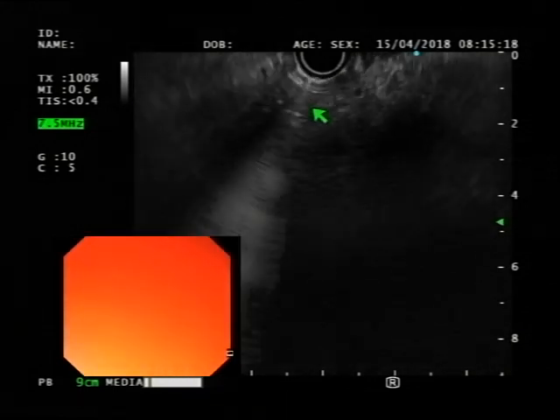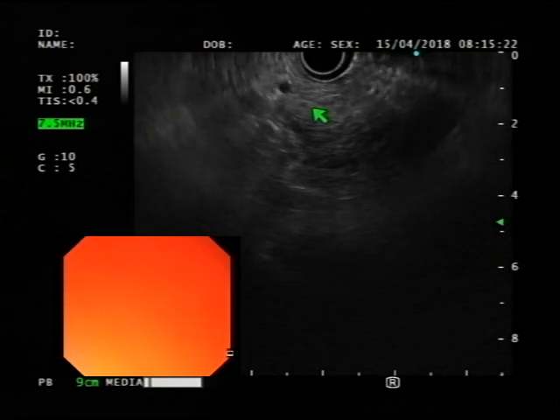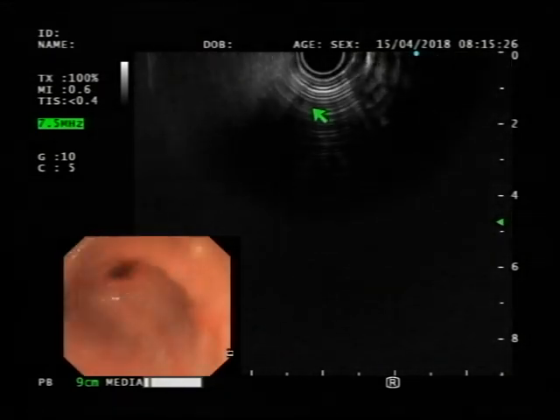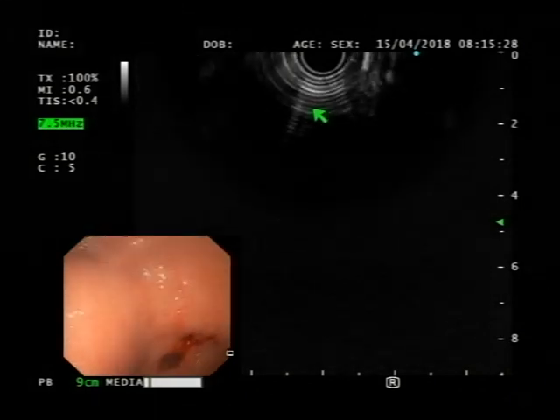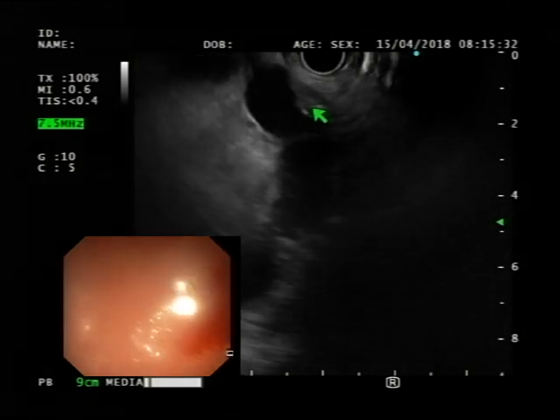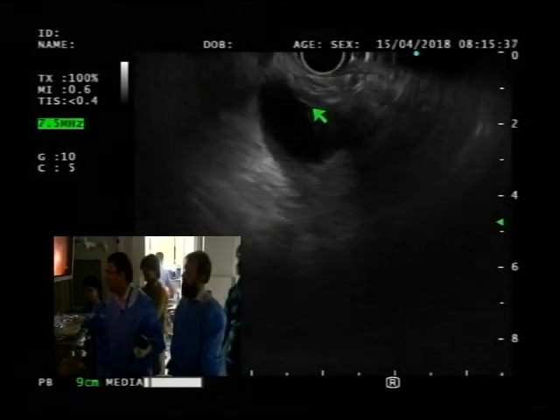So we don't see any structure on that. So I think you probably lost the position. Let me take a look. I haven't seen any mass, by the way, yet. And even though the pancreas looks extremely atrophic, this is a portal vein here.